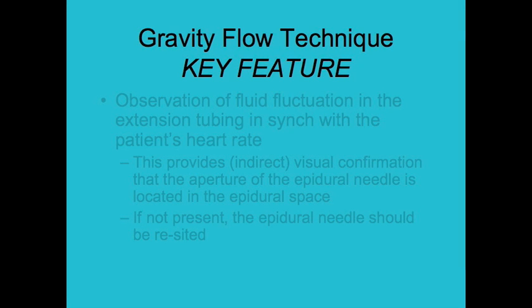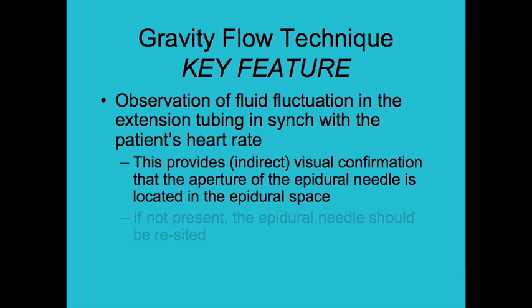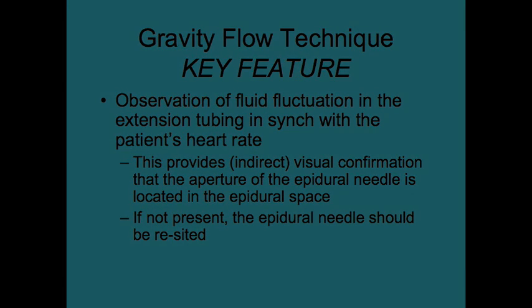Fluid fluctuation within the extension tubing in sync with the patient's heart rate is again noted. This is the key feature of the Gravity Flow Technique. Observation of fluid fluctuation in the extension tubing in sync with the patient's heart rate provides indirect visual confirmation that the aperture of the epidural needle is indeed located in the epidural space. If this fluid fluctuation is not present, the epidural needle should be repositioned. On many occasions, following a perceived loss of resistance, fluctuation of the fluid level did not occur, indicating that the needle tip was not in the epidural space. In all these cases, fluid level fluctuation was obtained by repositioning the epidural needle.